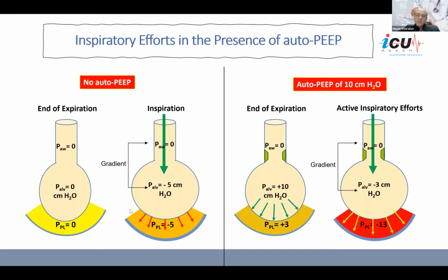Take a look at this here. First, you decrease the pressure. Then you create a gradient. As a result of the gradient, you have the flow. And why are the modern ventilators set for the flow, not the pressure? Because you can sense the flow at a faster rate. The microprocessor that we have can sense the flow much faster than sensing the drop in the pressure.